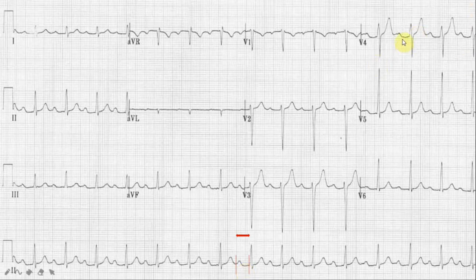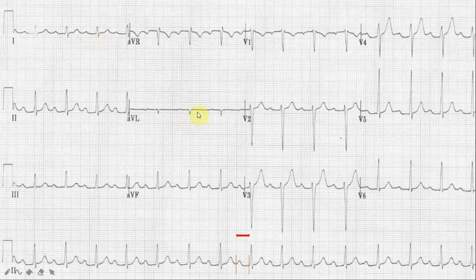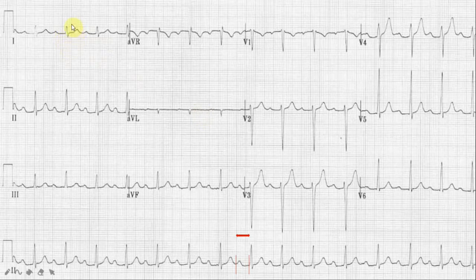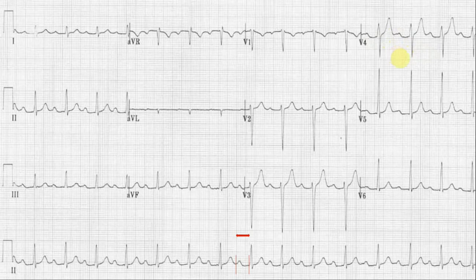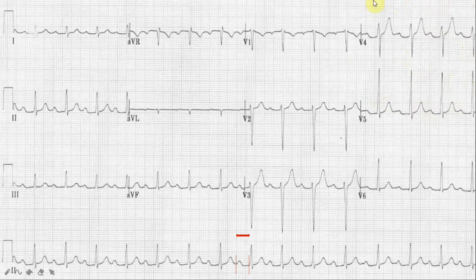A couple of additional things to note: look at AVL — the axis is normal between minus 30 and plus 90. But the QRS complex in AVL shows negative deflection, which looks almost like right axis deviation; however, in right axis deviation lead I would also show negative deflection, which is not the case here. What bothers me is if you carefully look at V4, there is a bit of elevation of the TP segment compared to the PR segment — they are not at the same level. Something unusual is going on, and we need to look into this when interpreting the ECG.